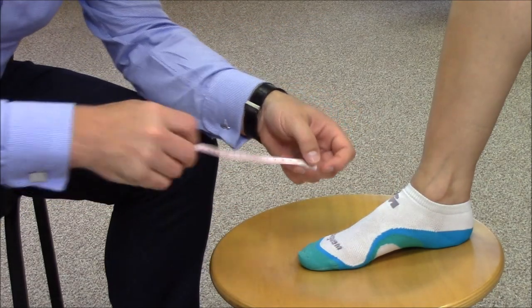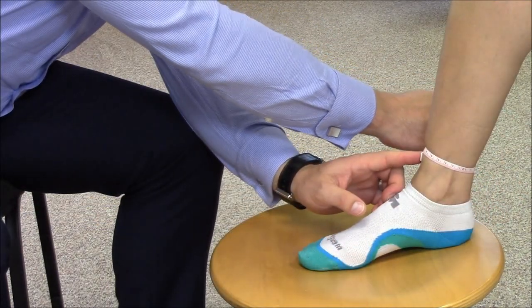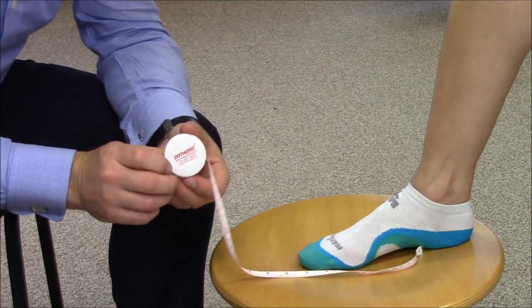Ensure you are using the correct size brace by measuring the ankle accordingly. The measurement should be taken in centimetres.